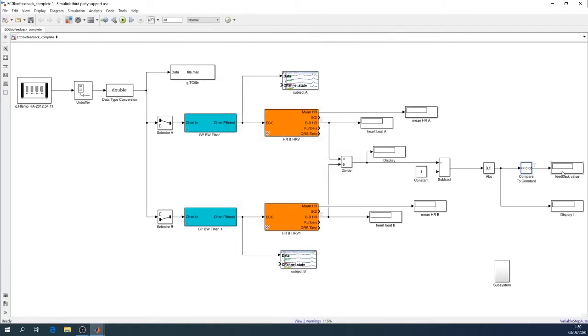And in the end, I am having that value. So if over here is 0.01, over here will be 1. If over here is 0.07, over here will be 0.